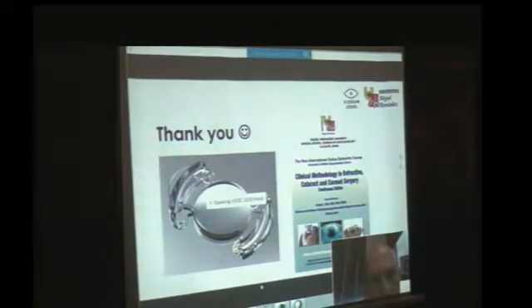Then this data is sent to the company, and with proprietary software, they create the lens for the optimal size. The process takes about 4 weeks, so the patient needs to wait 4 weeks to manufacture the lens at this moment of the clinical study. But yes, this is a customized lens in terms of sizing for the 12 o'clock meridian.